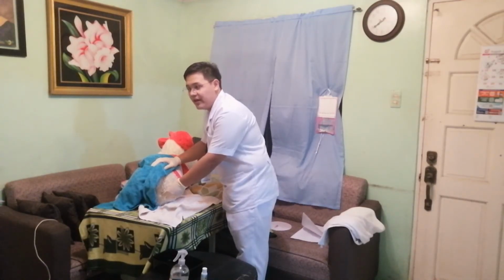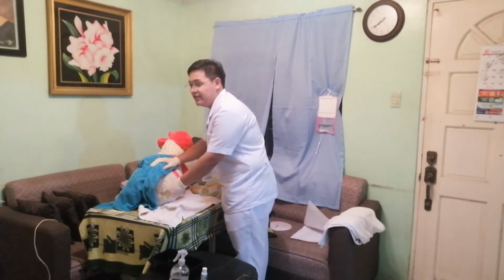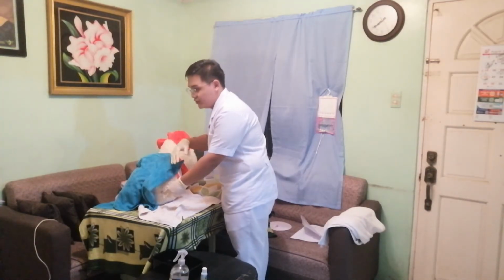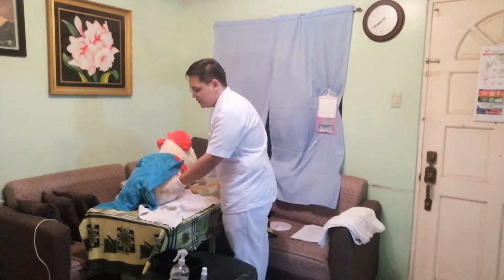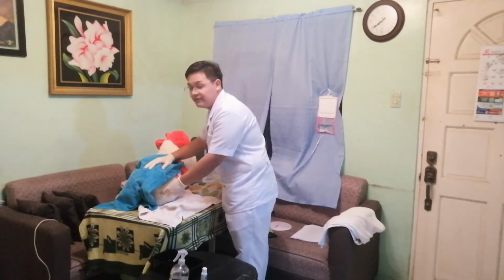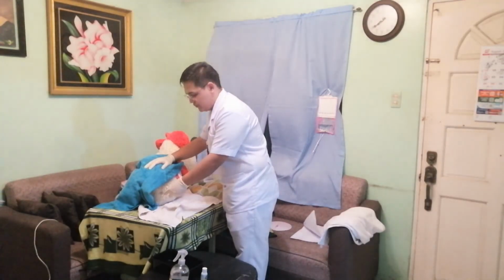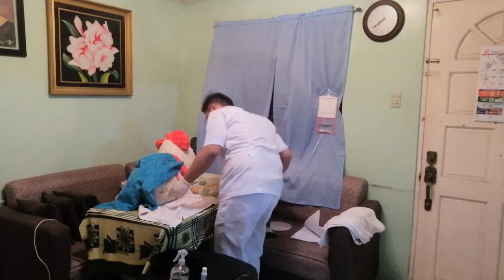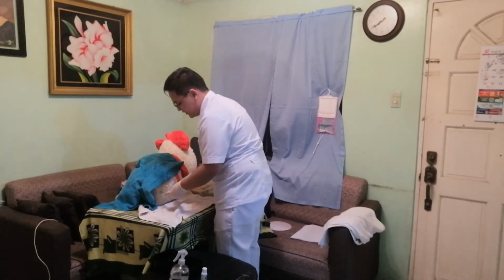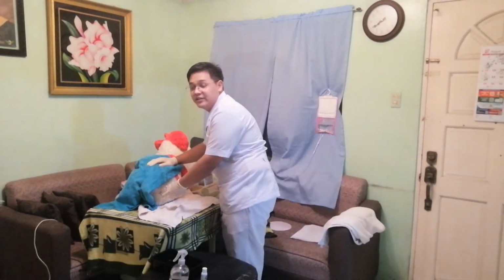For example, after we have instilled the solution into the patient's rectum, and the patient feels the urge to defecate, we will need to close the clamp again. So for example, we have closed the clamp or the tube.